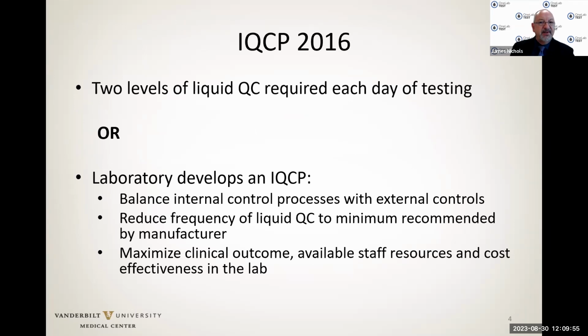This IQCP is intended to balance the internal control processes built into that device with external controls. This allows laboratory directors and laboratories to reduce the frequency of external liquid QC to the minimum recommended by the manufacturer, maximize clinical outcome with available staff resources, and apply cost effectiveness strategies in the laboratory.